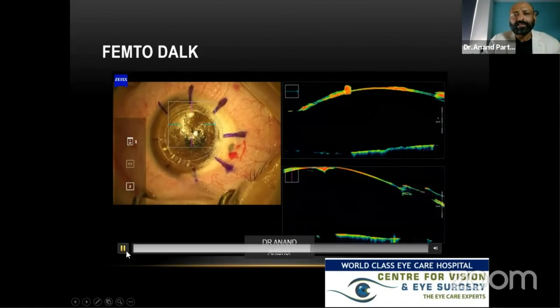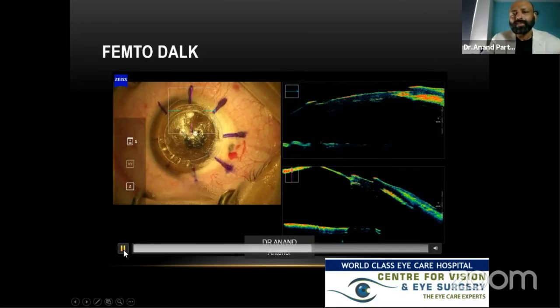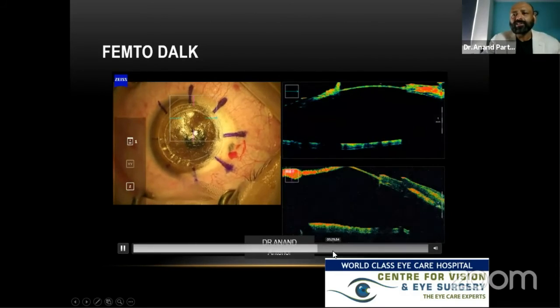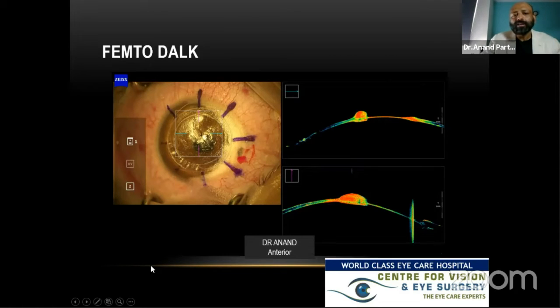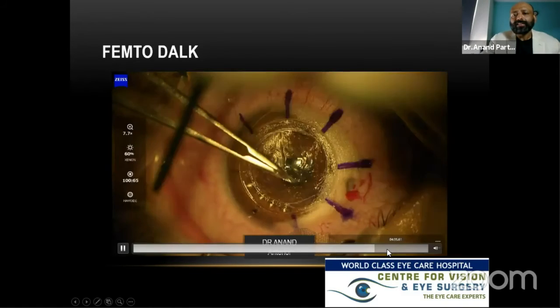This is the end of dissection. You can see the lump of the stroma, and we are at about 80%, which I feel in a patient with keratoconus will get as good results as getting a big bubble DALK, because we've done studies on that. The manual technique actually works quite well. This is the end of dissection. You can make out we are almost about in the central visual part, which is important. We are almost about 85–90%. And the peripheral dissection is done.